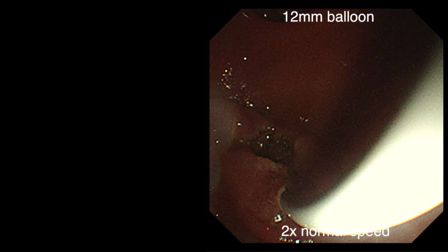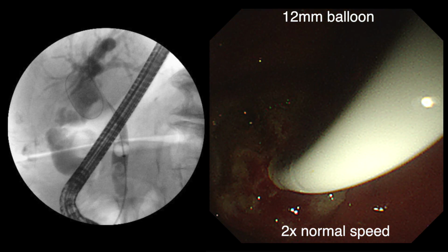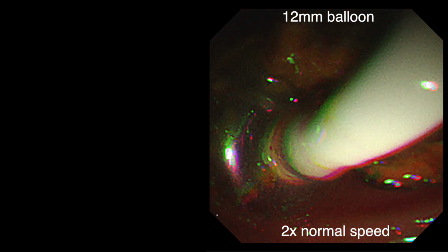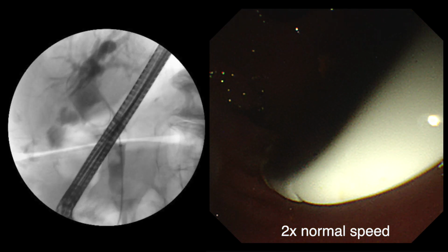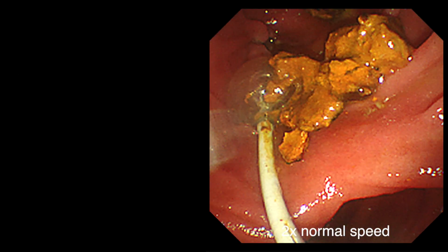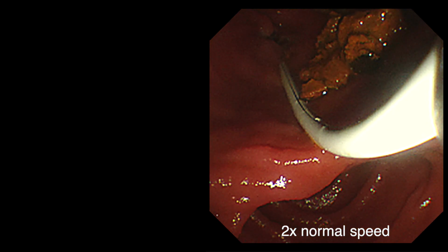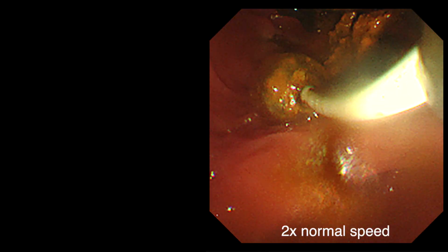I use a 12 mm extraction balloon and sequentially trawl the lower common bile duct, removing soft stones with each sweep. I continue sweeping with the balloon catheter until the lower common bile duct is clear.